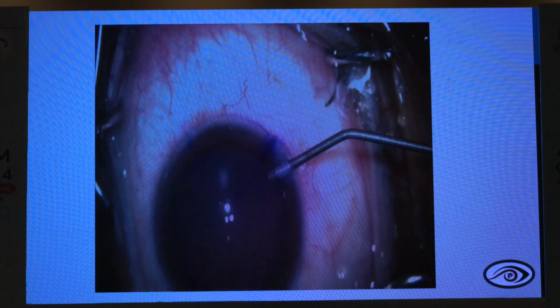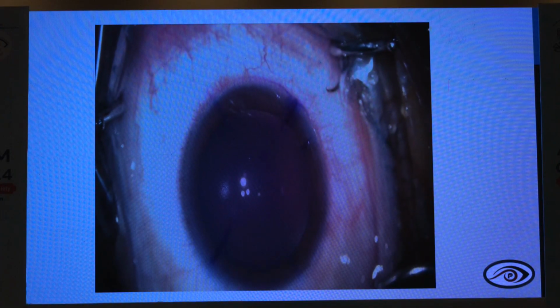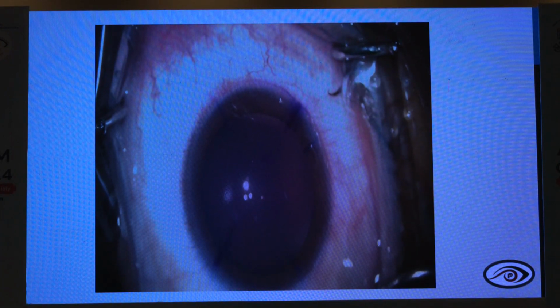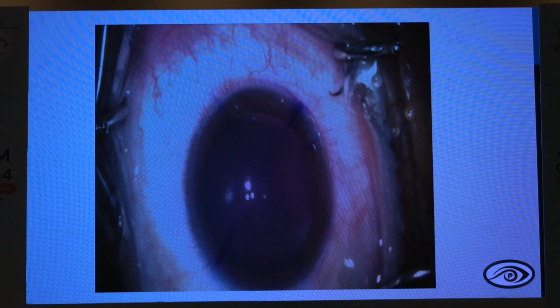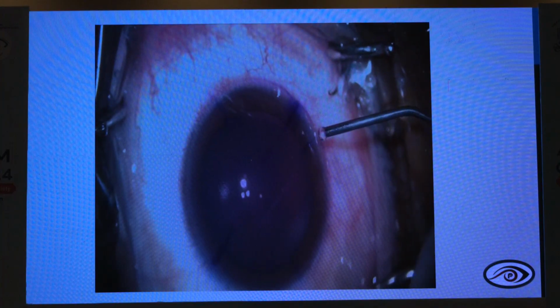So if you have got a good ACD, I don't think so. Definitely we have been doing this lens for almost 10-12 years. Absolutely there is no problem at all. See how I do, how everybody does the marking. Very simple. I think loading, Vardhaman already told.